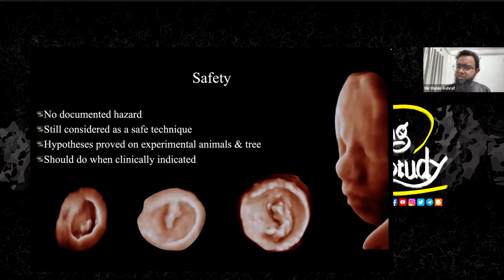And be sure that it is extremely normal to use color Doppler in early pregnancy. We use color Doppler because we want to evaluate, or exclude, congenital cardiac abnormalities as early as possible. Transposition of great vessels and some other abnormalities can already be detected before the 10th week of gestational age with the help of ultrasound. I have told you that early fetal echocardiography will become popular in the next 10 years. So if you think that ultrasound can cause congenital abnormalities, you are living in 1980.